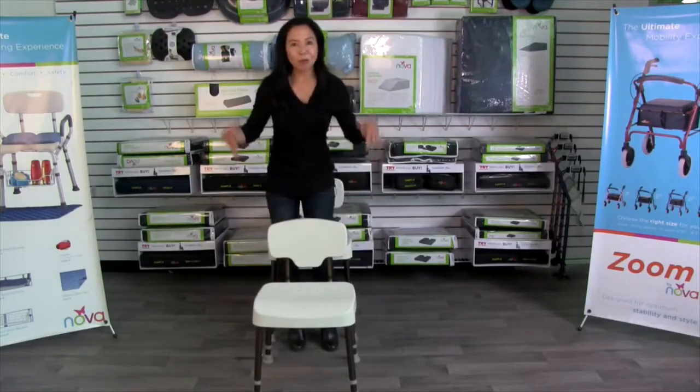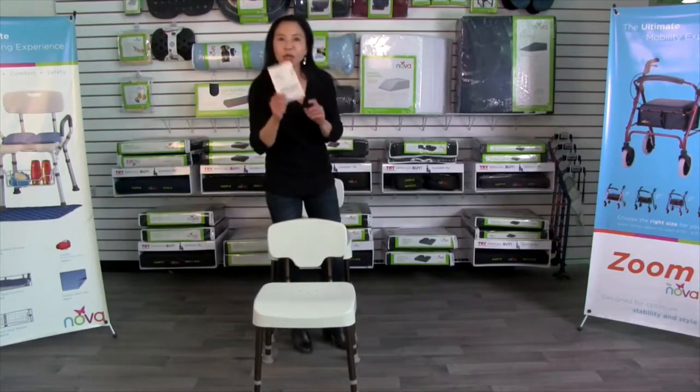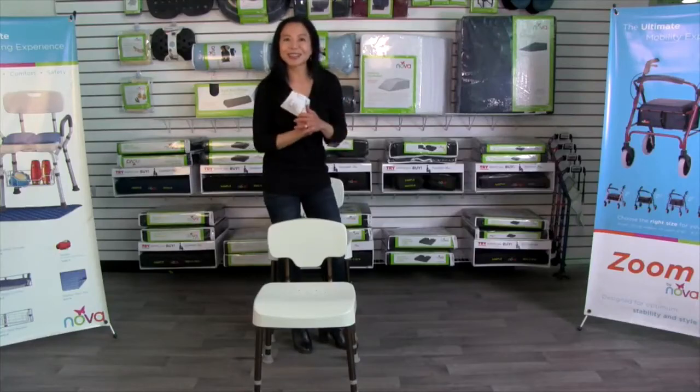There you go — your bath seat is all assembled. As with all NOVA products, it will come with care, use, and assembly information, and most importantly, customer service information so you can contact us anytime.